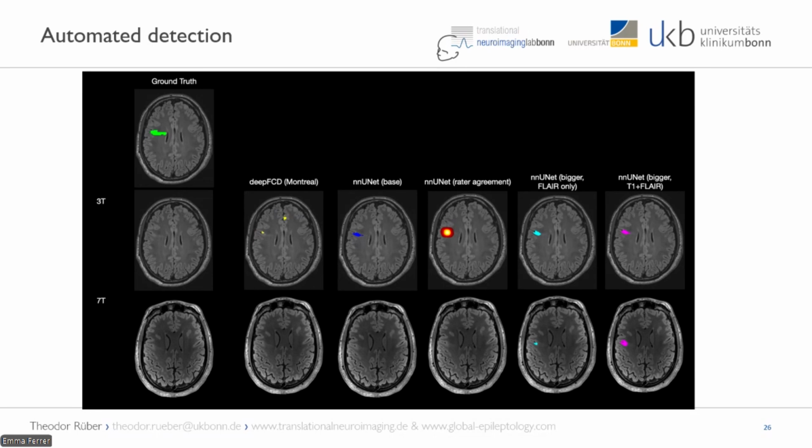And we can see that only 2 of the models find the lesion in the 7T, so they find it more in 3T. But here again, does it mean that 3T is better? No, it only means that this algorithm has been trained on 3T, right? And that may go for the radiologists themselves as well. So the reason why they do not perform better at 7T is not because 7T is not better, but because they're just not used to looking at 7T. If they were, then they would find more than at 3T, or we don't know. But that's exactly what we have to test.